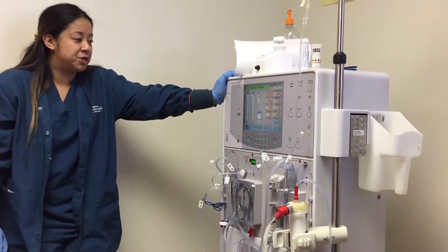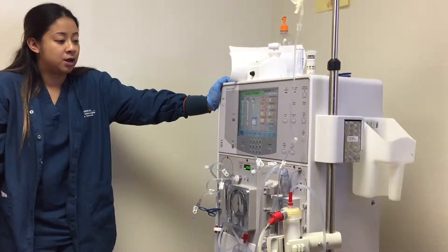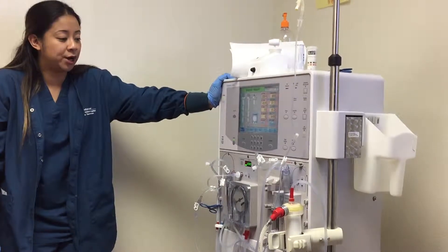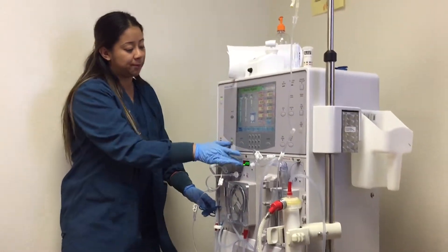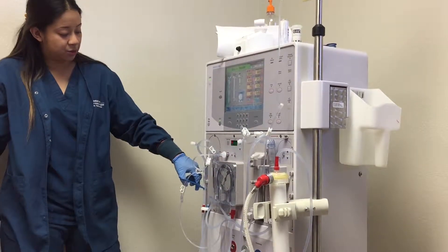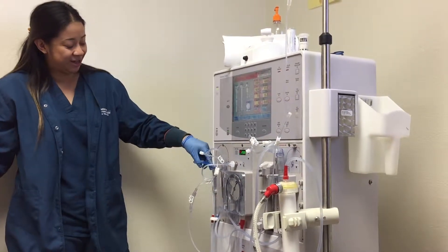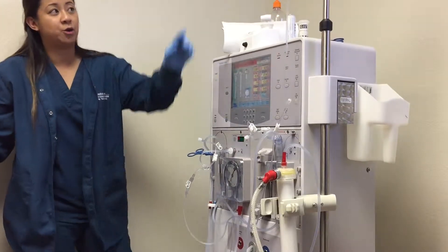Basically the same thing with the open return — you're checking to see that the blood is being returned. The blood turns kind of a light pink, light red color. Once that's done, you want to stop your blood pump. Then you want to return the arterial through gravity. So you're gonna clamp above — think above arterial, above the T-line — and now you're returning your arterial by gravity.